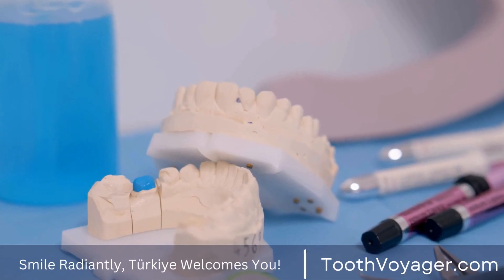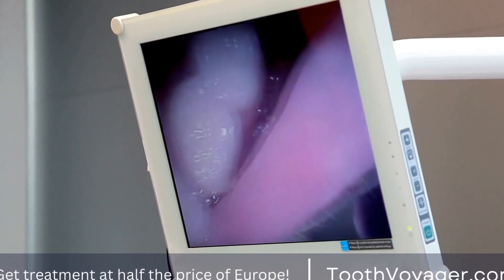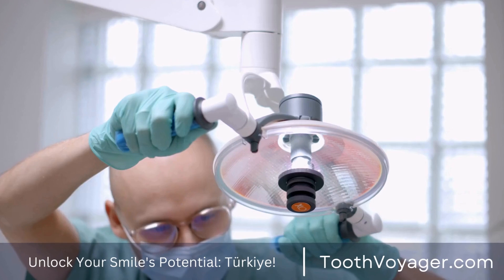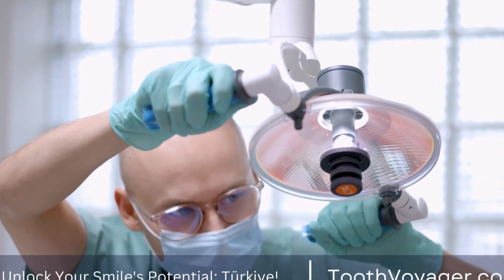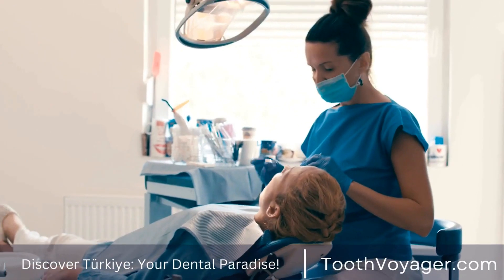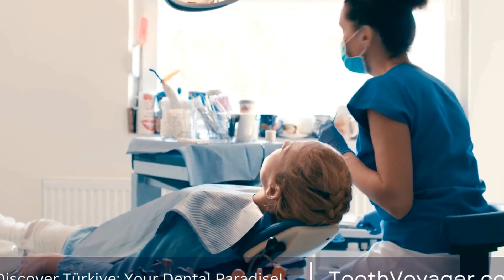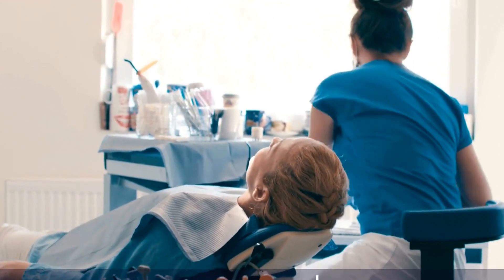Types of Dental Bridges. There are several types of dental bridges, including traditional bridges, cantilever bridges, and Maryland bridges. Traditional bridges are the most common type and consist of pontics held in place by dental crowns on either side of the gap. Cantilever bridges are used when there is only one natural tooth next to the gap, while Maryland bridges use a metal or porcelain framework bonded to the back of the adjacent teeth.